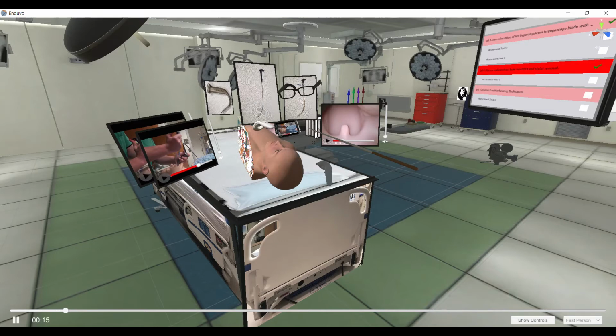So imagine that you've inserted the laryngoscope blade, you performed your rocking motion, you have a beautiful view of the vocal cords. You could then have an assistant pull the patient's right corner of their mouth outward to facilitate insertion of the endotracheal tube. You would then be handed the endotracheal tube, and you would insert the endotracheal tube at the right aspects of the patient's mouth, and then begin to follow the laryngoscope blade posteriorly behind the tongue.